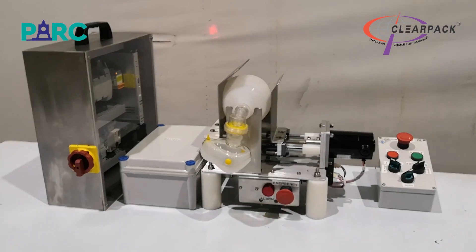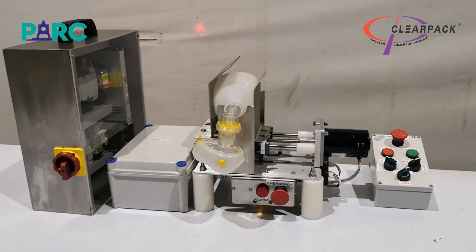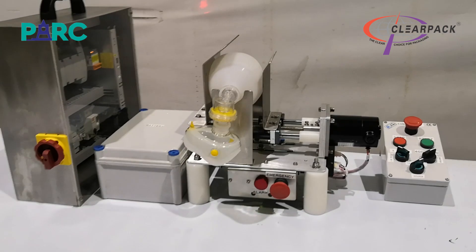The operator pendant is attached to the control module with a long flexible cable so that it can be kept at the patient's bedside or moved easily by the attendant when it has to be operated.